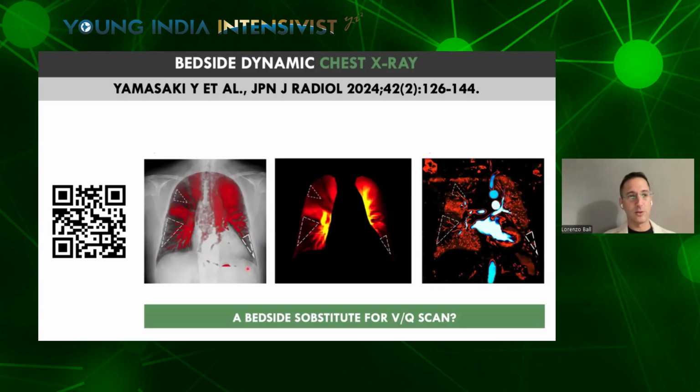It could be a substitute at the bedside for the ventilation-perfusion scan, which at the medical school we are taught is the gold standard for ventilation-perfusion assessment and for diagnosis of pulmonary embolism.